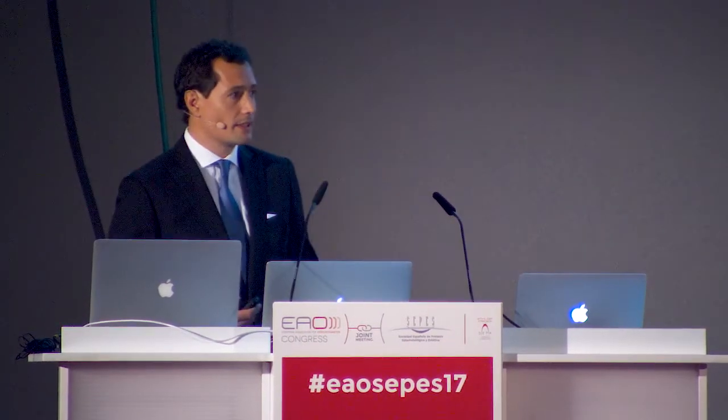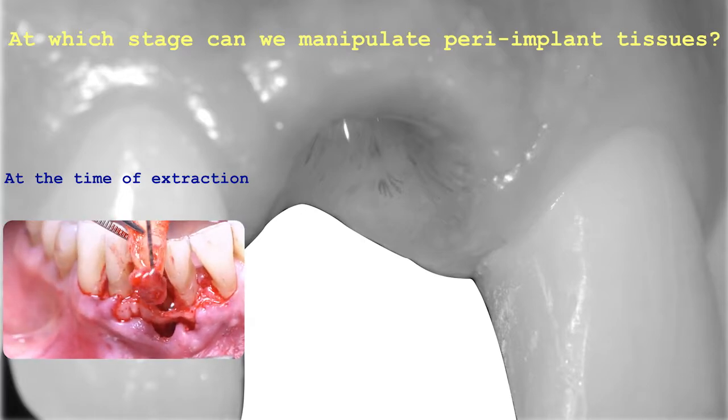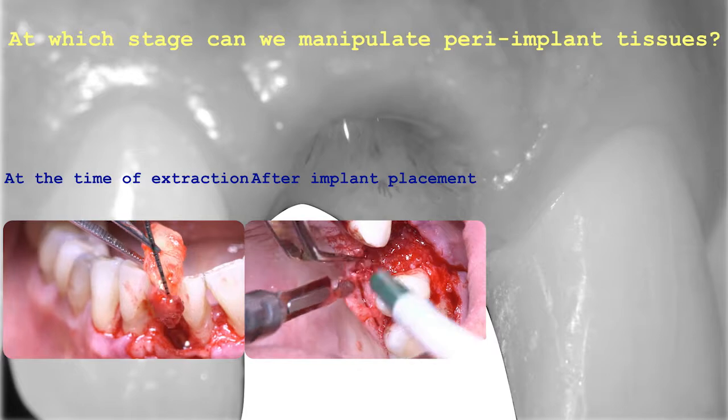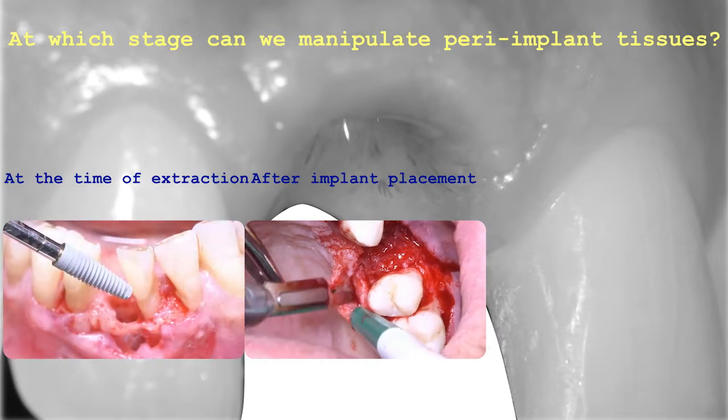The topic of my presentation will be focused on the clinical application of Osstell in cases where there is a need of retreatment, or cases where we had, for example, failures, or cases where bone grafting or soft tissue grafting is not an option. So we can start manipulating peri-implant tissues at the time of extractions. For example, when we do immediate placement, we can simultaneously perform also guided bone regeneration. We can do soft tissue manipulation at the time of uncovery. We cannot certainly do bone augmentation at the time of the uncovery, but certainly we can manipulate soft tissue.